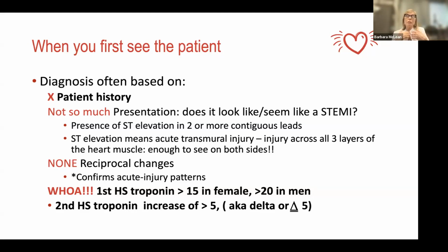One thing for sure is if you are able, my friends, if you have an EKG machine, you know how to do an EKG, you know how to load it, you know how to send it to your cardiologist. If you don't, you've got to grab an EKG tech. But if you're able, when a patient is telling you that he's having chest pain or chest pressure or chest pulling, you want to do an EKG during that time, if possible.